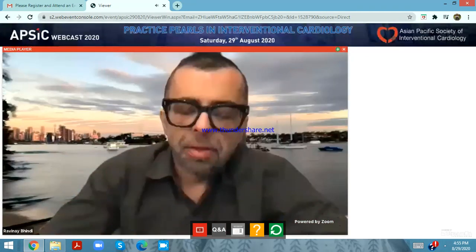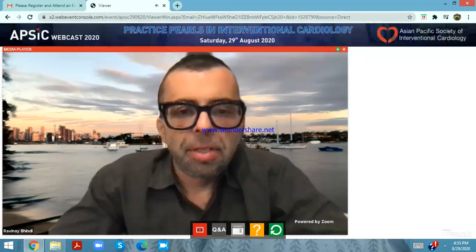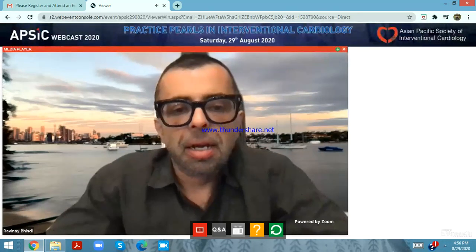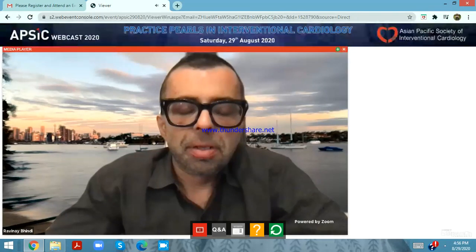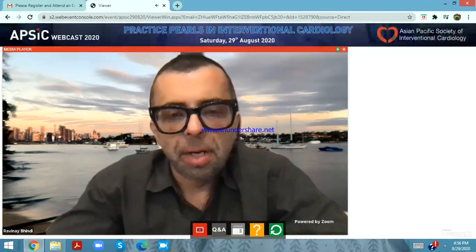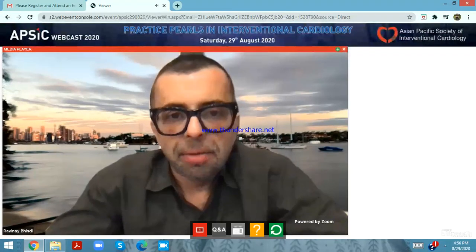Look, I think Sal has touched on some of the critical challenges we face in the cath lab dealing with calcified lesions. The utility of high pressure, appropriately used, is so important. We've all utilized super high pressure balloons to overcome challenges. In the cath lab we have the combination of delivery of the device to the lesion, getting optimal expansion, and then the risk of rupture and subsequent consequences. So I think you've touched really nicely on the utility of these devices. I'd be very intrigued to see what everyone else on the panel uses. We use a combination of super high pressure balloons with ancillary atherectomy devices and lithotripsy balloons now, which we'll hear about. The challenge is to do things safely and get the most optimal result.